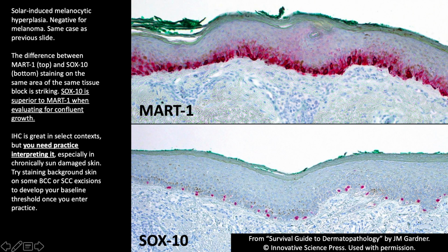So here's a contrast. Again, same case. Look at MART1 or Melan-A if you like. It's basically the same thing. And here's SOX10 on that same case. And look at the dramatic difference.